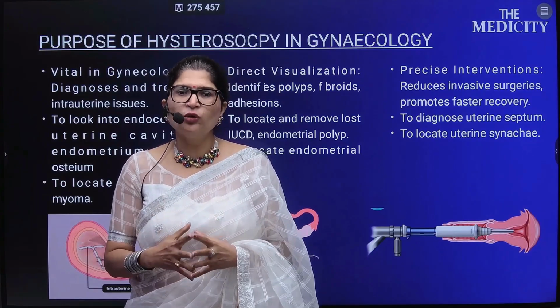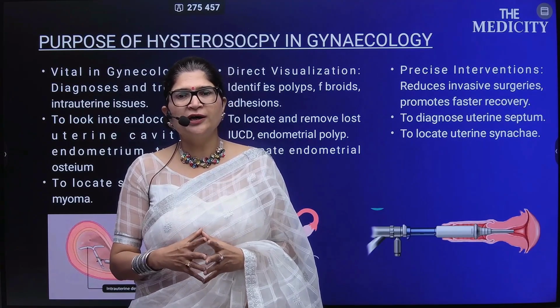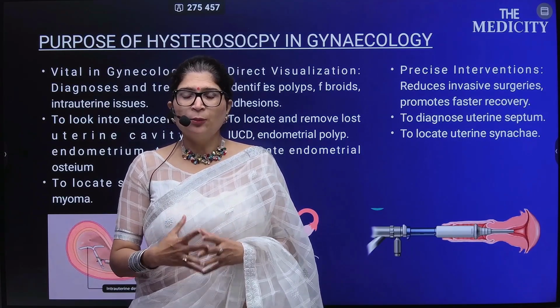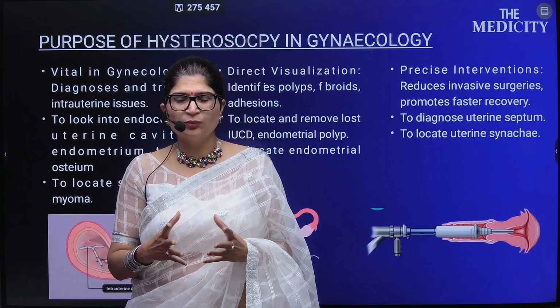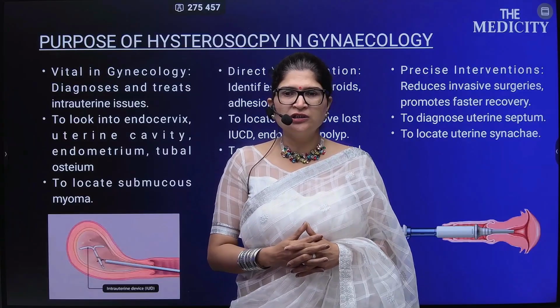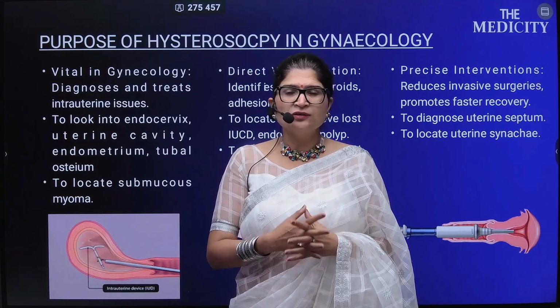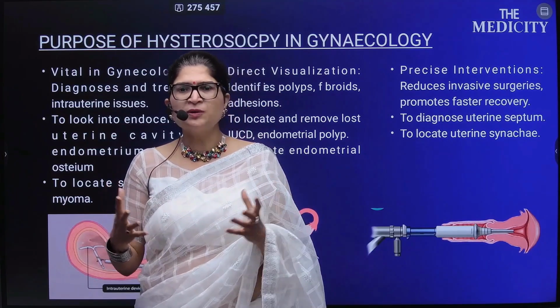It helps to locate and remove the lost IUCD, endometrial polyp, and to locate endometrial cancers. Now, precise interventions: it reduces invasive surgeries, promotes faster recovery, helps diagnose septums in the uterine cavity, and locates synechiae. So these are the broad-spectrum uses of hysteroscopy these days.